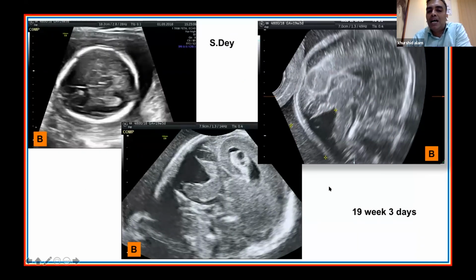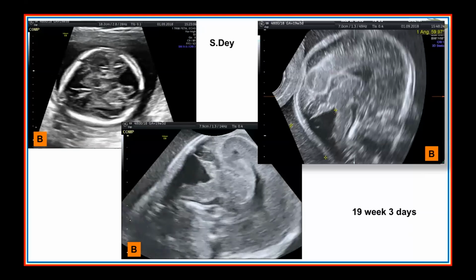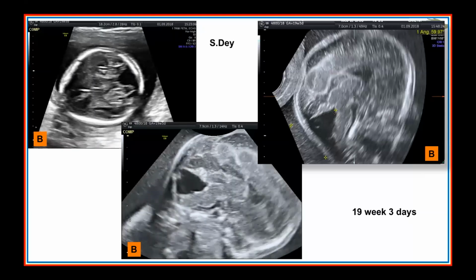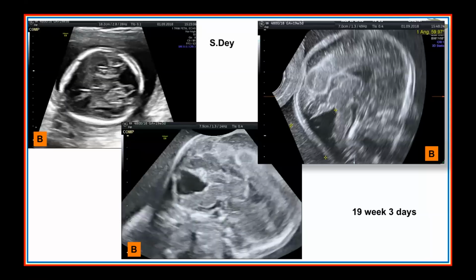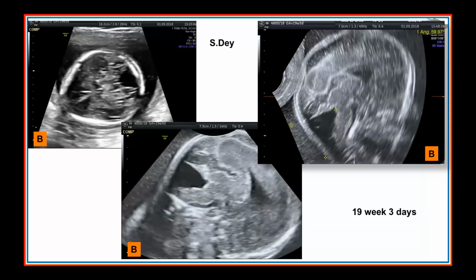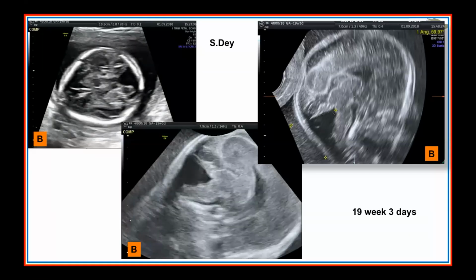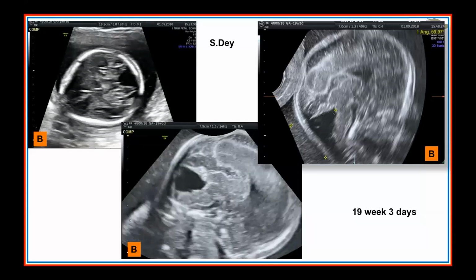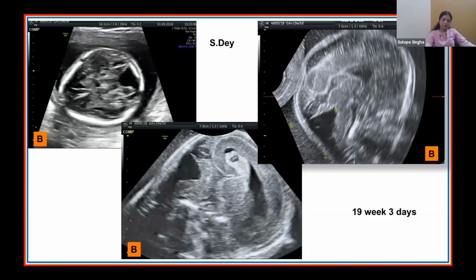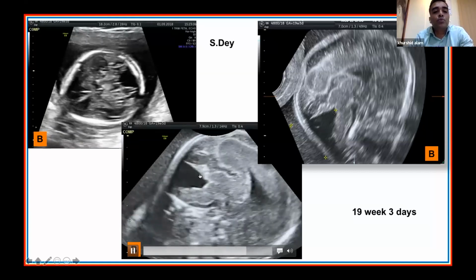Samiran, can you quickly wrap up this image and say what are the clinching points here? There is a cystic deformity in the posterior fossa, and in the sagittal section we can see the BV angle, which is less than 65 degrees, and so we can say that this will fall in the Dandy-Walker complex variant. Okay, in Dandy-Walker complex, there are three types of deformity: classic Dandy-Walker malformation, Dandy-Walker variant, and mega cisterna magna. Yeah, thank you so much, Samiran.